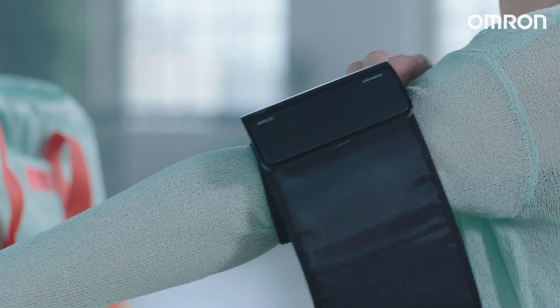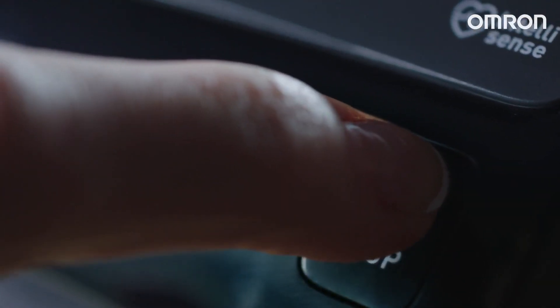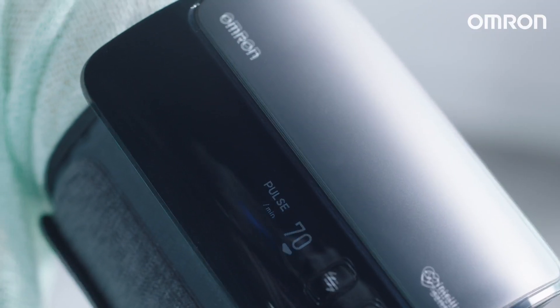To take a measurement, place the cuff on your upper arm, secure it, and press the Start-Stop button. Then wait until the readings appear on the screen.